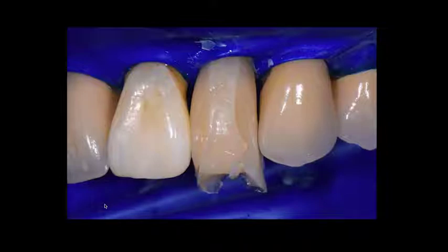So here you can see the tooth right after the injection overmolding and with the matrices removed. And so again, I want to point out the difference in the value between this middle zone, which did not have the Mylar matrix next to it, and then here what we call the Mylar zone.